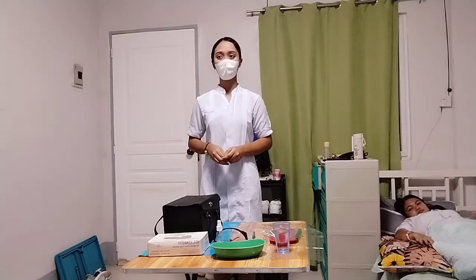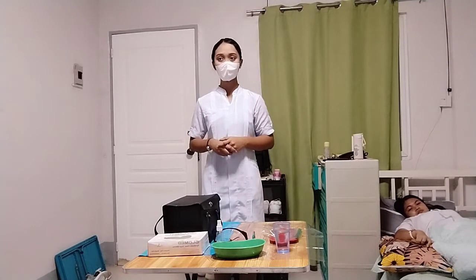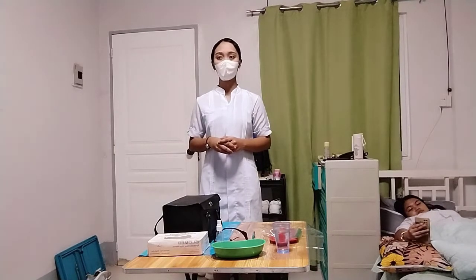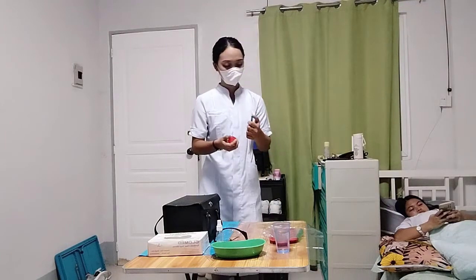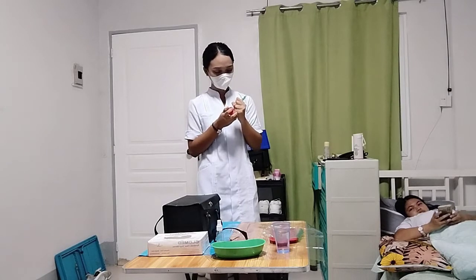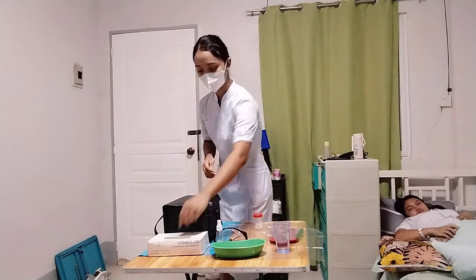If the client can perform the task without assistance after the instructions, call out the nurse or healthcare provider as soon as the specimen is produced or available. Check the specimen label with the client's identification. The label should include the client name, identification number, time specimen was collected, route of collection, and identification of the person obtaining the sample. And then put on disposable gloves and goggles.